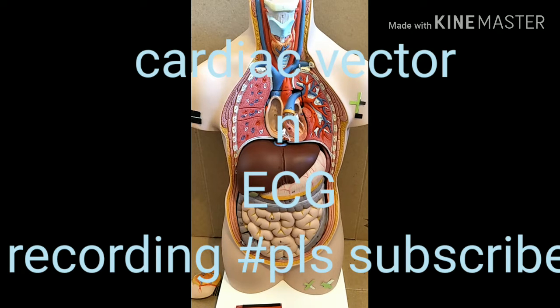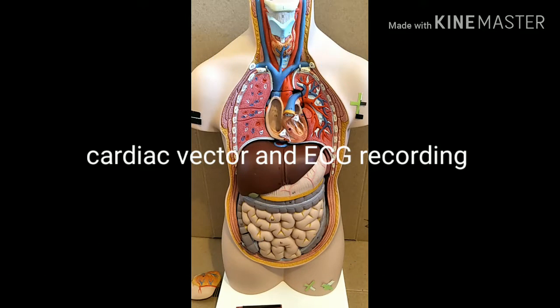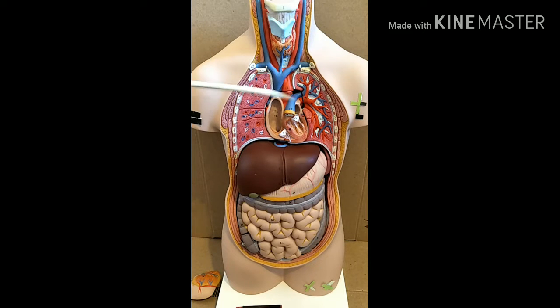In this video, I'm going to talk about the electrical activity in the heart and the ECG recording. I have pasted the bipolar limb leads electrodes, which are your combinations of positive and negative electrodes. Lead 1 has the positive electrode on your left arm and the negative electrode on your right arm. This is lead 1, this would be lead 2, and this would be the combination of lead 3.